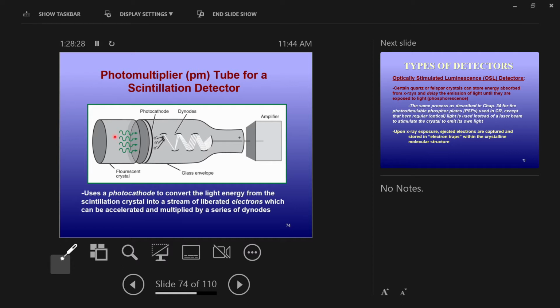So I want to take one big step back because what we're doing is we're converting energy, right? We're taking X-rays and converting it, okay? So I need to give you guys one major principle that this operates on. This operates on the principle of the conservation of energy, okay? Who's heard anything about the conservation of energy before? All right, Francisco, what do you know about conservation of energy? You've heard that there is something called the conservation of energy, right?